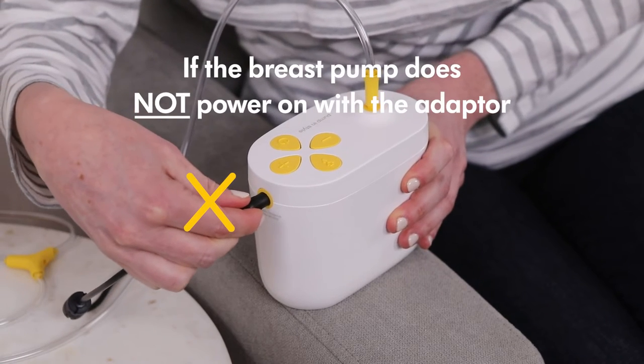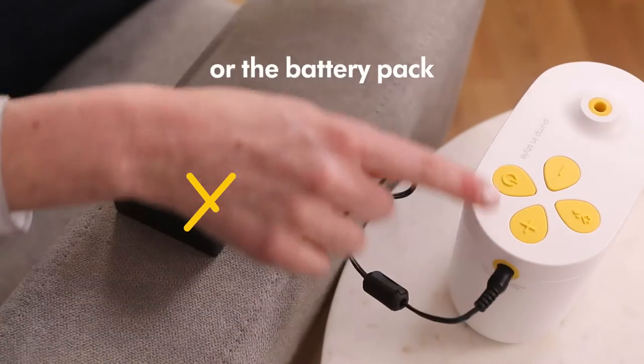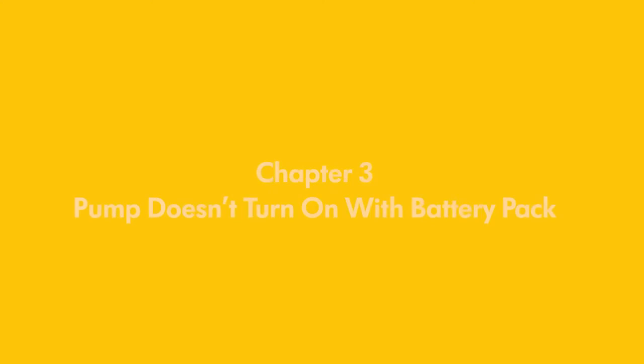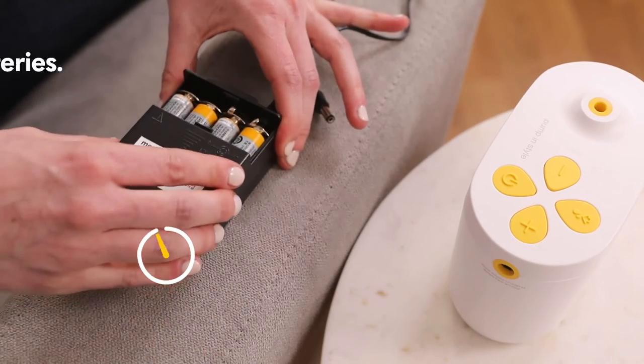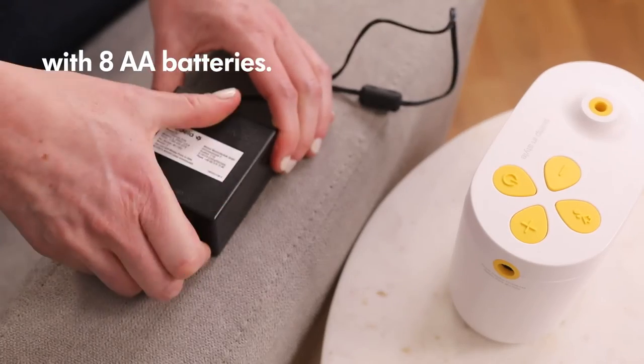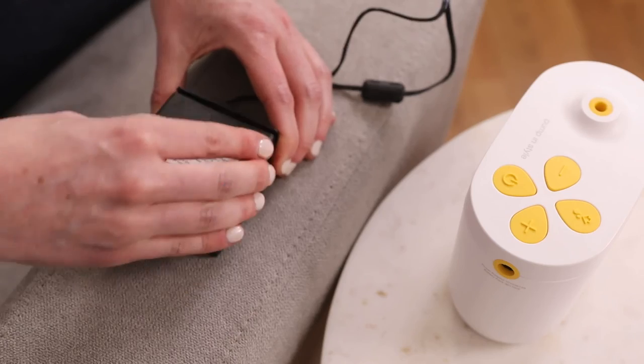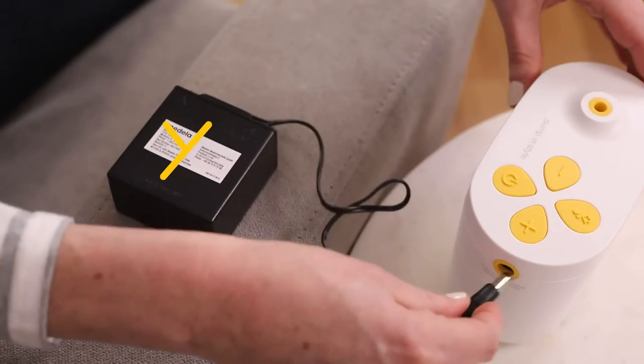If the breast pump does not power on with the power adapter or the battery pack, contact Medela Customer Service. The battery pack is designed to provide up to two hours of pumping time with eight AA batteries. If the battery pack isn't powering the breast pump, try installing a new set of batteries. If the new batteries have been installed and the pump is still not working, contact Medela Customer Service to replace the battery pack.